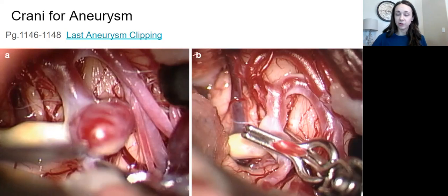You will find this under instruments, equipment, and supplies. So carotid set for carotid artery exposure available for hemorrhage control. So this is if the bleeding in the brain is so bad that we have to go clamp off the carotid artery. So you don't want to be in that situation, but you got to be ready for it.